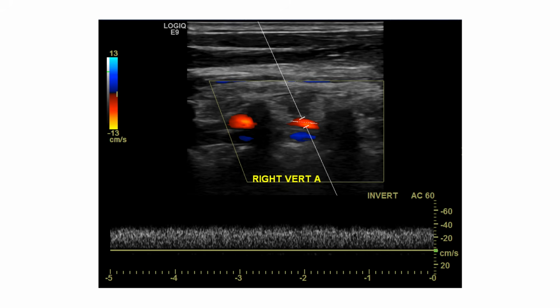So here's an interesting case. Look at this vertebral artery waveform, WTF. Let's do some investigating here. First, where's our probe? It's a steered box, so let's draw the lines. And we want the line that's outside of the box. That's the side that our transducer's on. There we go. Let's start with this bottom blue vessel here. It's blue, and blue's on the top, so this flow is going towards the transducer. And this red guy here matches to the bottom, which is going away from the transducer. So we know our orientation's correct.